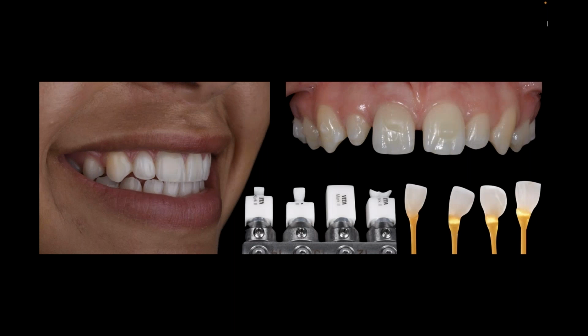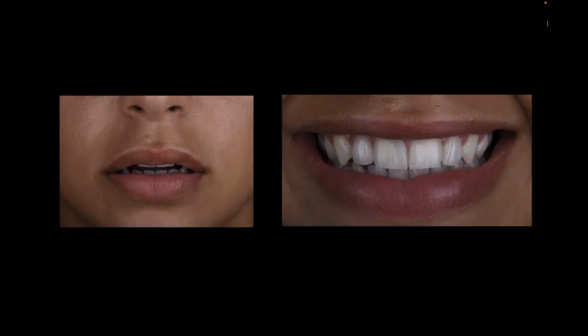And I find that the coloration works so much nicer on these. I'm sure many of you who make lithium disilicate or silicate veneers, as much as we try to make them look as pretty as we can and put our stains on the outside, I'd argue they never look as nice as a feldspathic veneer could look, especially because the staining seems to really take into the surface much better with the feldspathic veneer.